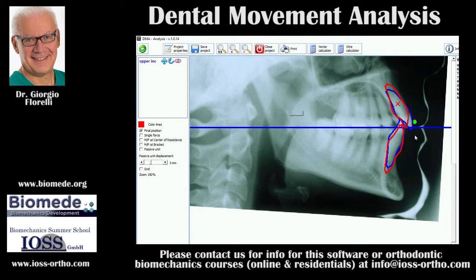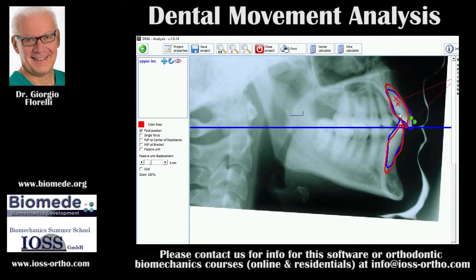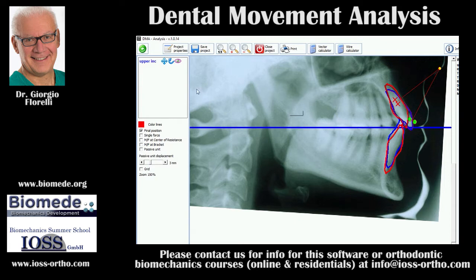I start moving it to bring it to the red position — the red position is my final position as I have decided in the occlusogram. I can make a translation, I can make a rotation, I can bring it parallel to the red position and move it exactly. I'm very close — okay, that's the movement I'm planning. You see from the blue to the red: there's a center of rotation, a lot of intrusion, some retraction, and a change of inclination. This is the center of resistance.